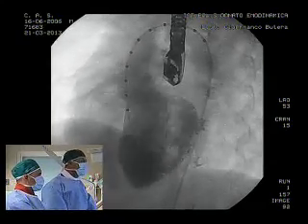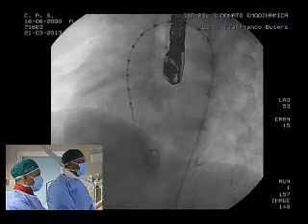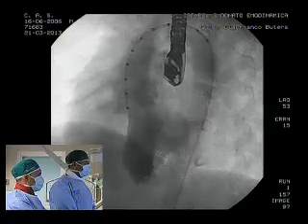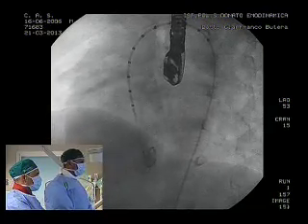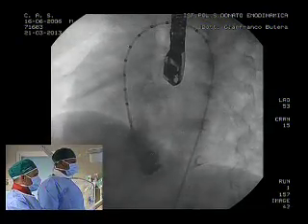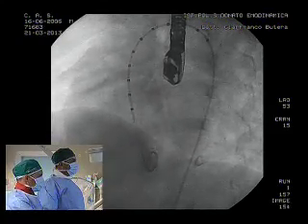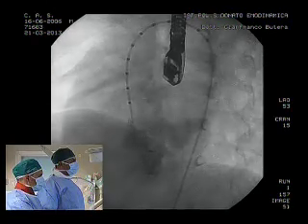Yeah. Okay. The septal defect, the way I read it, the anatomical septal defect on the LV side is maybe 7 to 8 millimeters. That's right. Do you agree, Aziz? We agree so far. Good. Okay, then it's okay.